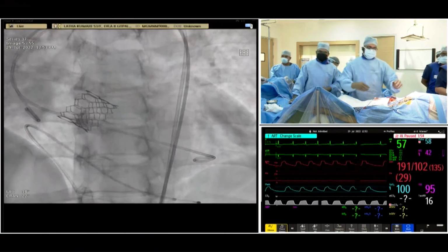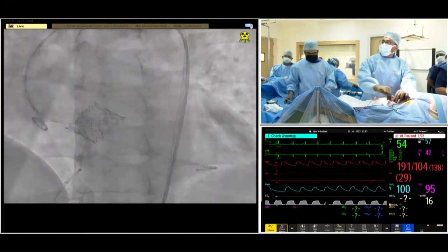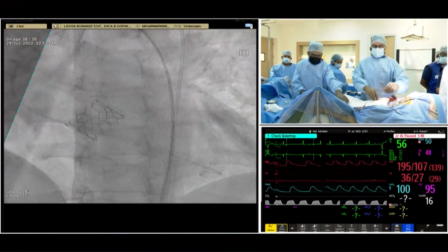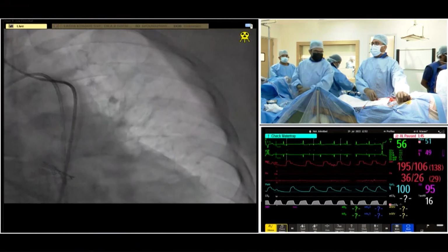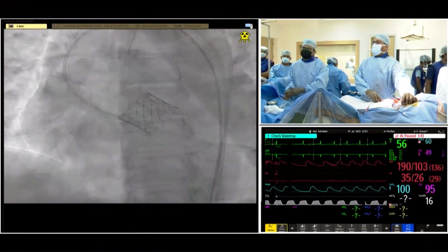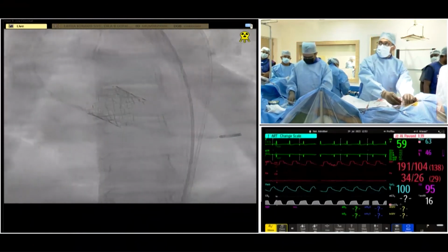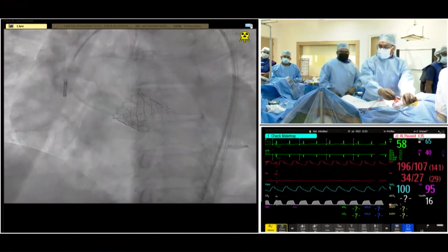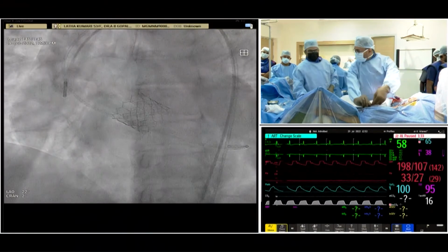Okay, good. So let's take the pacemaker off. We don't need a pacemaker. All wires are ready to close, guys. Get a final pressure, and then we're done. That's a really nice depth. Right, we're done. We're just going to do a pressure evaluation, and then we'll be done. We'll just show you pressures, and then we'll be done.